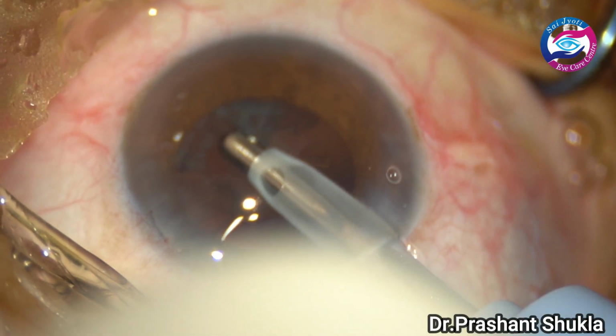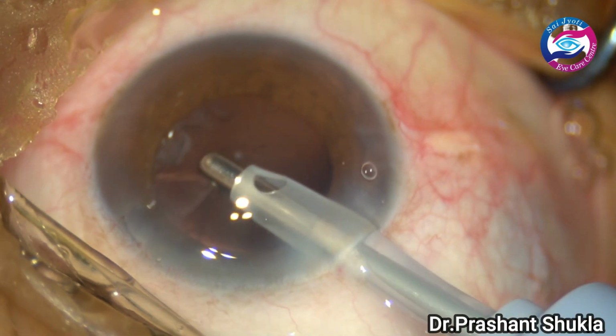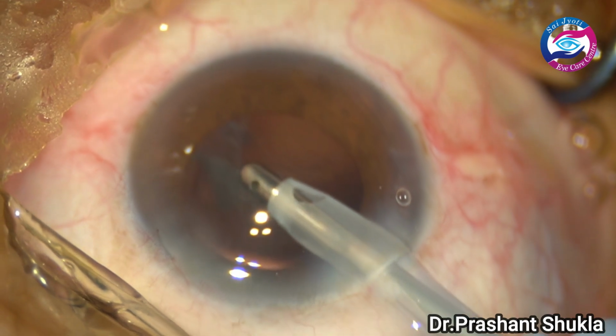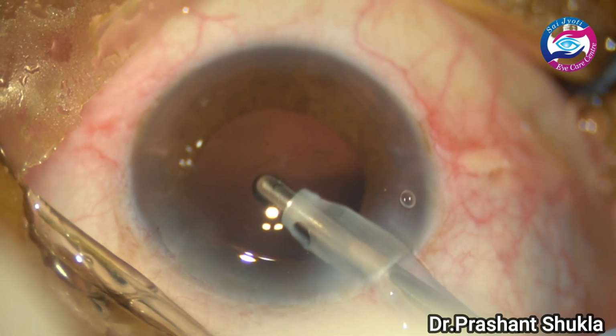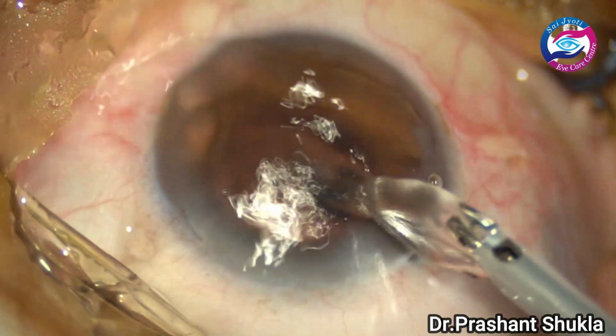Now is the time to remove the cortical matter, and it is being removed using a coaxial IA handpiece. Vacuum being used is about 350. Bottle height is around 100, and gradually all the cortical matter is cleaned up. The bag is clean now.